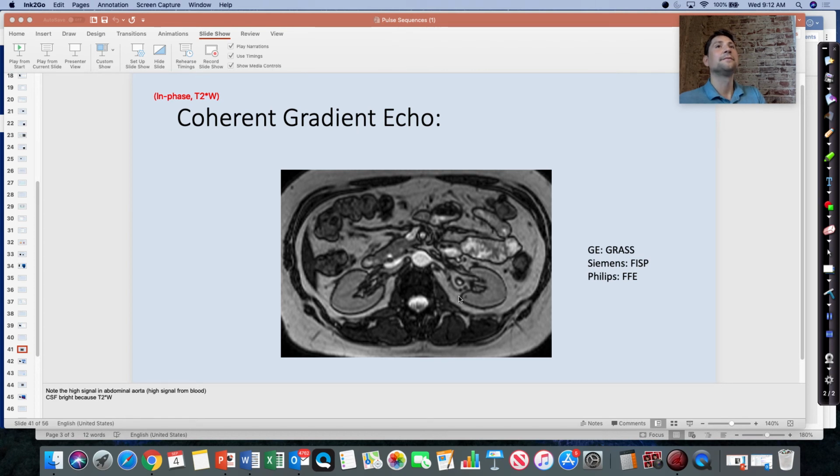You don't. That's actually a concept in and out of phase, and usually on the out of phase imaging, you get these rings around the organs. So our image quality is not as good. But we're able to image angiography, and we get an image that doesn't have any motion on it. Because we're imaging the abdomen, and our patients are breathing, and they can only hold their breath for like 20 seconds. And I'd rather have an image with a little bit lower quality compared to having one that has a motion artifact streaking across the image.